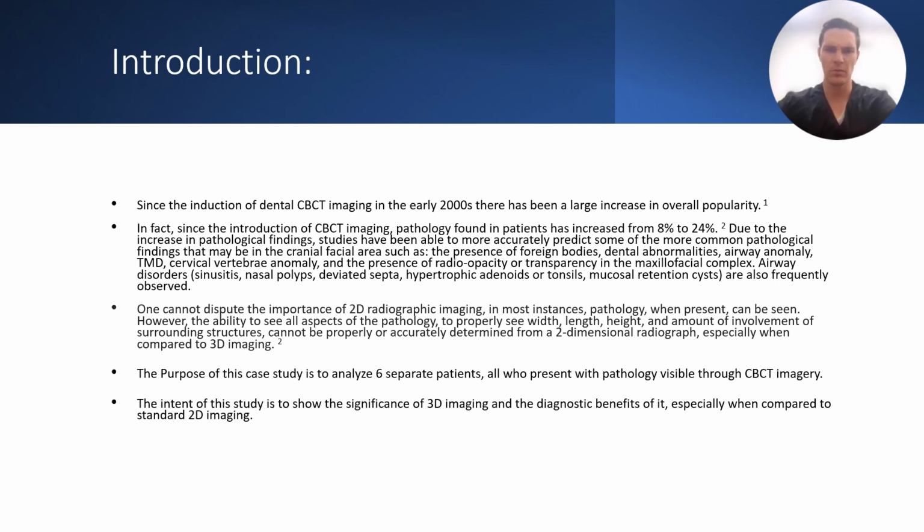Again, the purpose of this is not to discredit 2D imagery in the orthodontic world, such as a panoramic or a lateral ceph, but more to show you the benefits of using it in cohesion with, or as an adjunct of, 3D imagery or CBCT imagery. We will be analyzing 6 separate patients, all presenting with visible pathology through CBCT or lateral ceph, and comparing the difference between a lateral ceph and CBCT imagery to see if there is a big discrepancy or not.